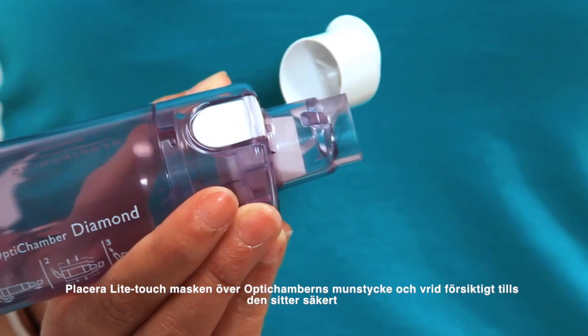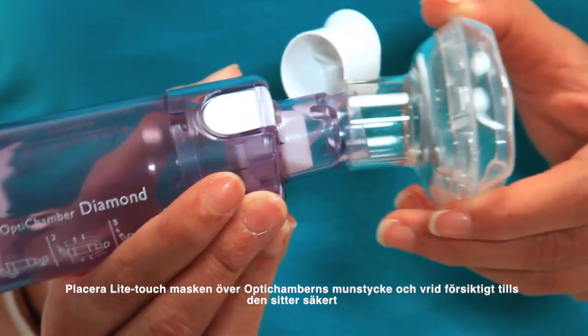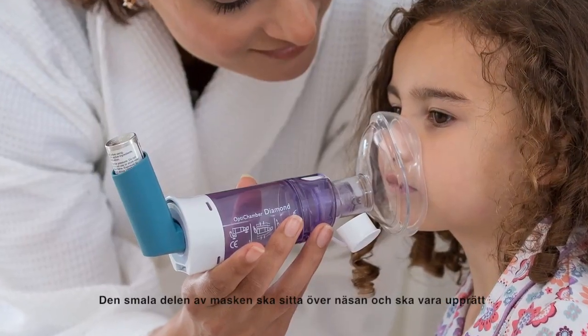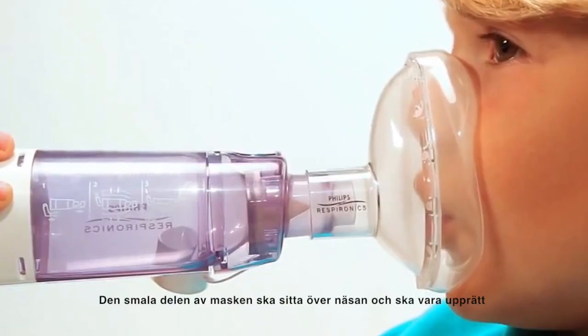Place the Light Touch Mask over the diamond's mouthpiece and gently twist until it fits securely. The narrow portion of the mask fits over the nose and should be upright.